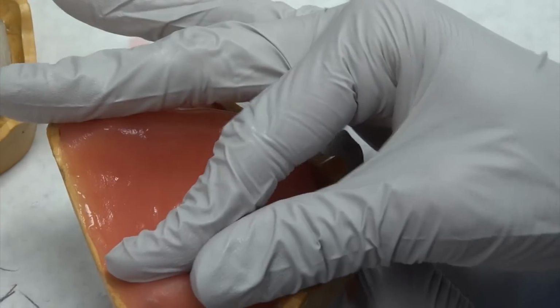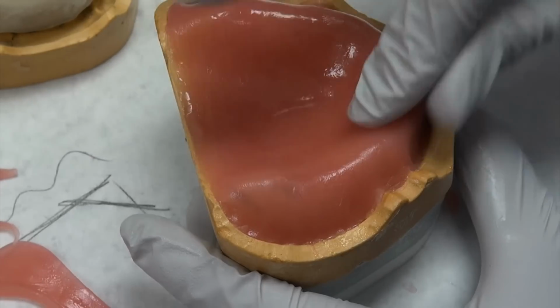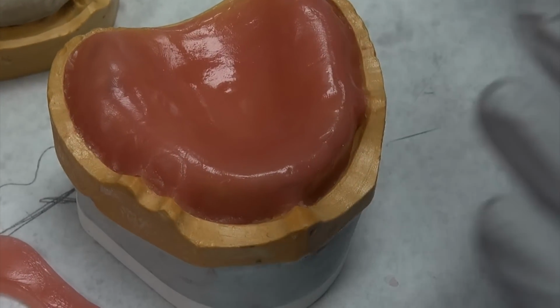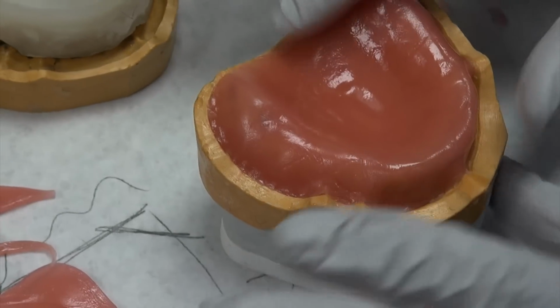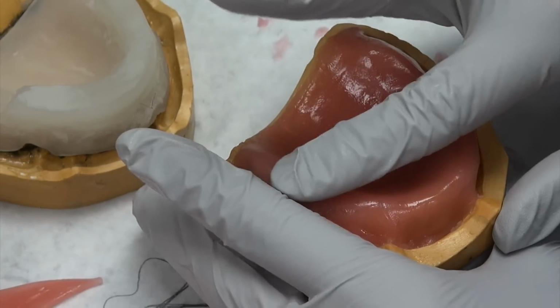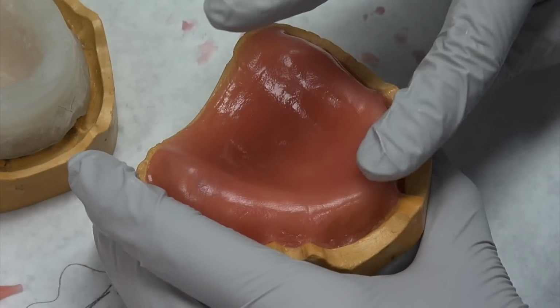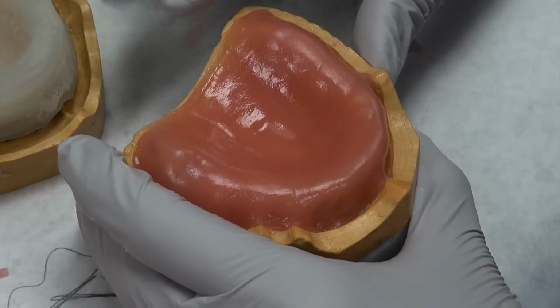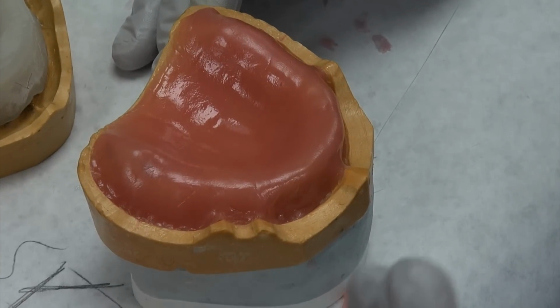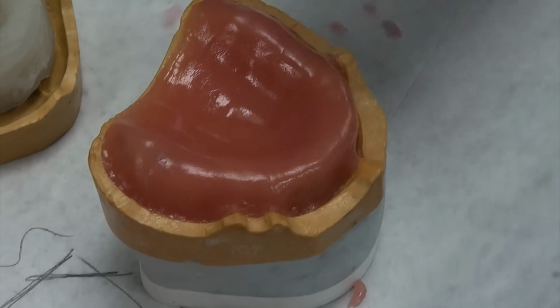Now once you do that, we're just going to go ahead and roll it down, right? Make sure that there are no air bubbles in there. Now what that brings us next to is you're going to have varying dimensions here that are going to be of importance. You want the crest of your ridge to be at 1 to 1.5. Now keep in mind that initially you were at 2.5. So what that's saying is you need to reduce an entire millimeter of depth.